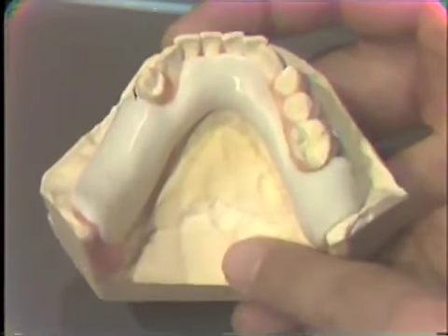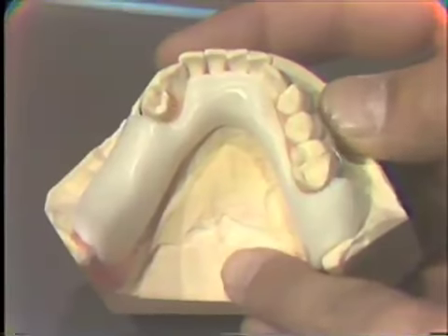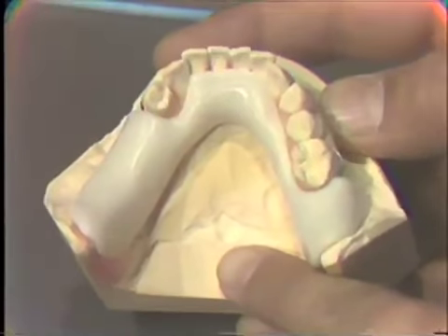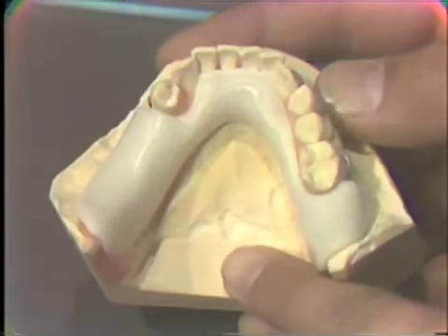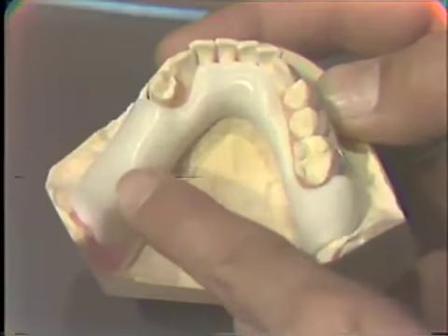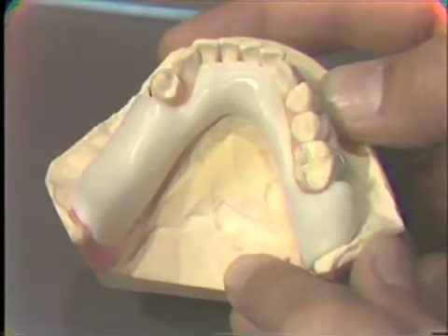Now, these can be made for Class 1 patients, edentulous patients, partially edentulous patients. They can be used in the maxillary arch also. And this is a mandibular Class 2 situation where we have the partially edentulous area on the one side. That is the area we're going to replace.